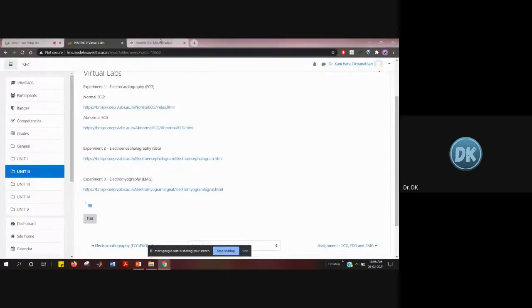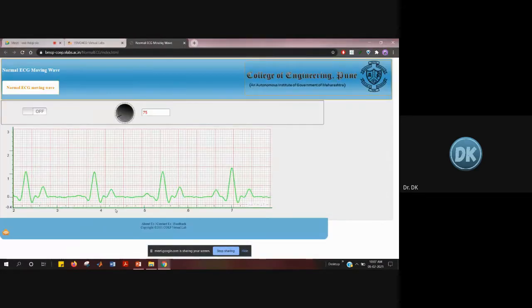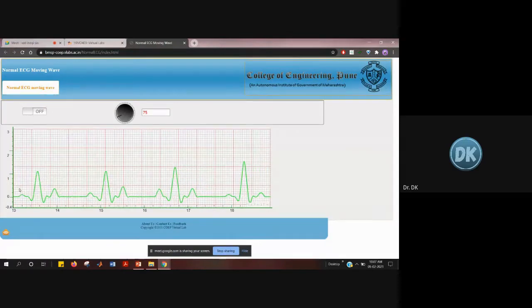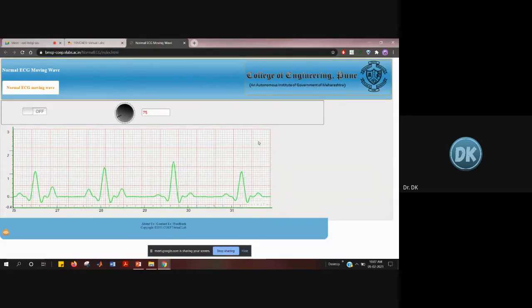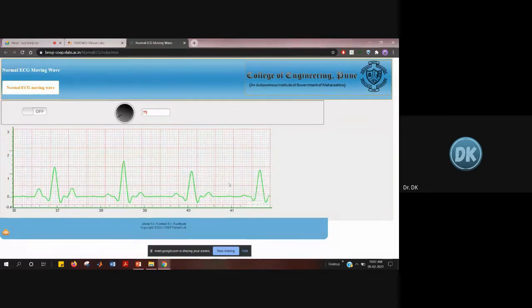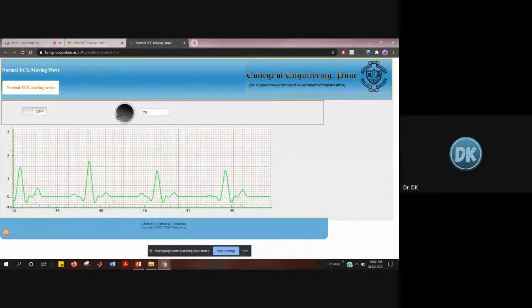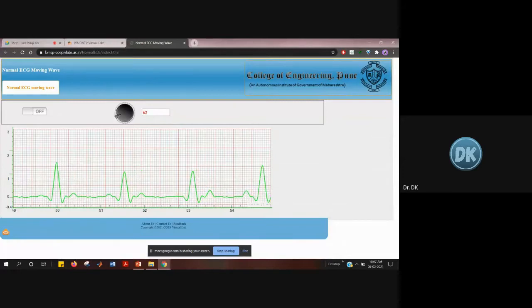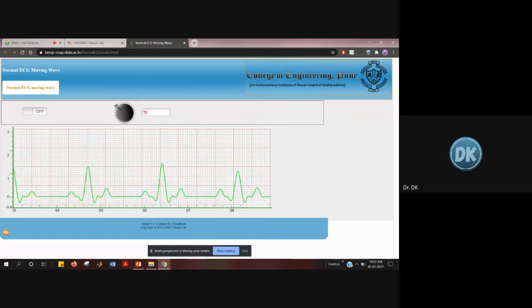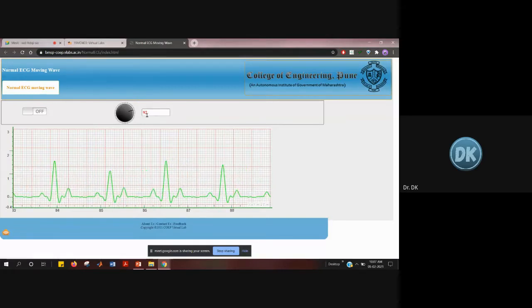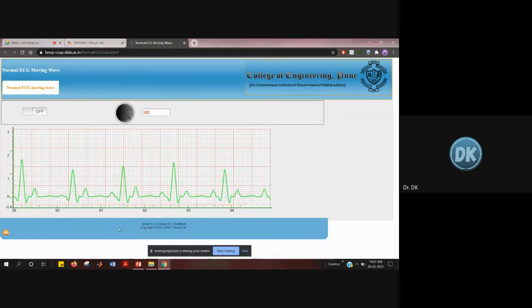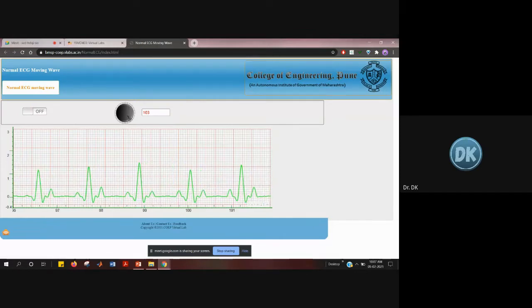This is how the normal ECG waveform looks, with different peaks. The theory details will be covered separately, so don't worry about that. For this experiment, what you have to do is change the waveform duration — previously it was 72, now I've changed it to 70. If you increase it, you can see more peaks. You have to change the value and observe different waveforms.